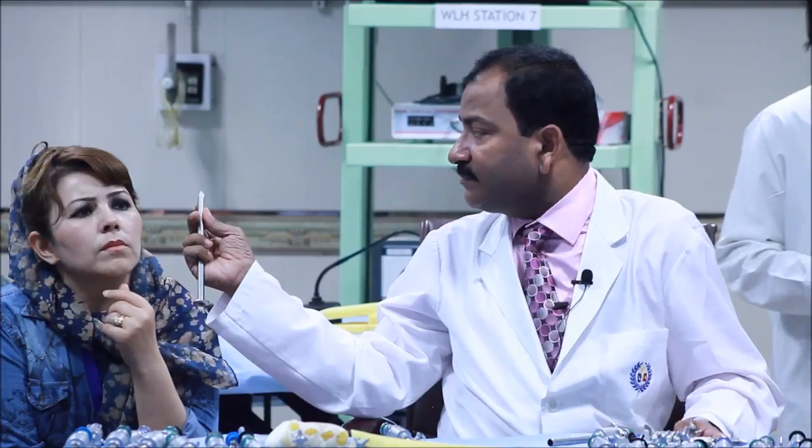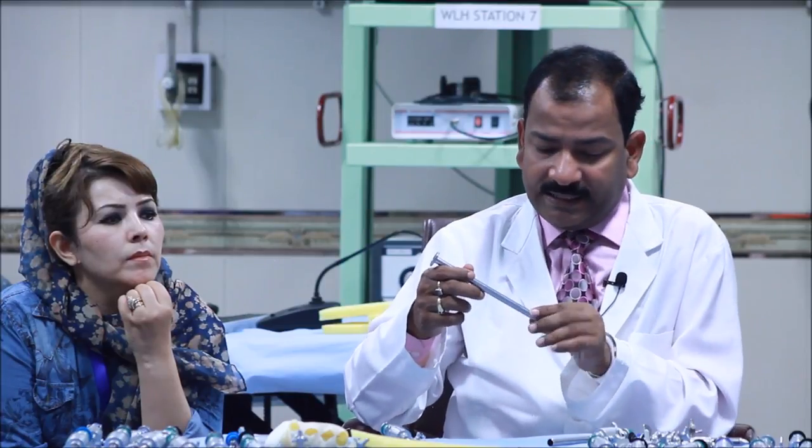The trocar has one eye at the tip. This eye is communicated with the back, and you see there is one hole in it. This is the eye. This is to give a hissing sound. As soon as the trocar enters, the gas starts leaking from there. This is called the hissing sound. This hissing sound is very useful.